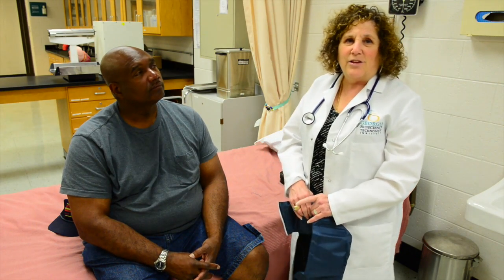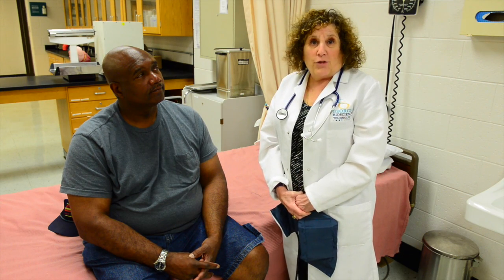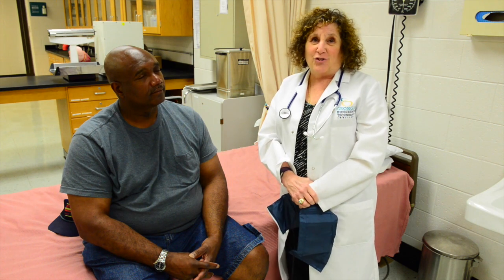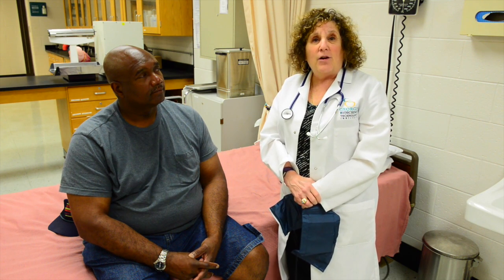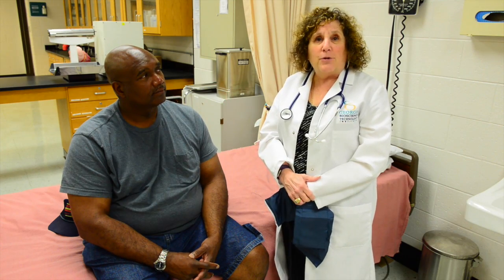Hi, I'm Ellen from East Squared Home School. We're going to be taking our fourth vital sign, blood pressure. But before you do blood pressure, you have to determine what the patient — in this case Michael — what his palpatory systolic pressure is.